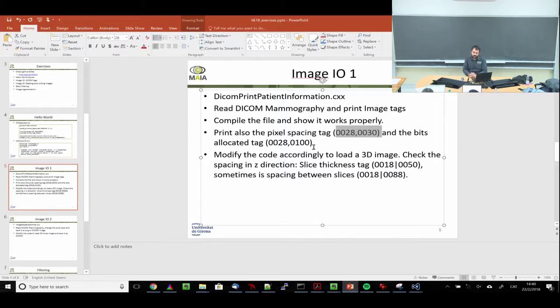Are you familiar with pixel spacing? More or less means no. Pixel spacing, slice thickness, and all these things? No? Should I comment something about this? Yes? Okay. So, you know what a pixel is? My voice was better like this. Hello. What is a pixel?